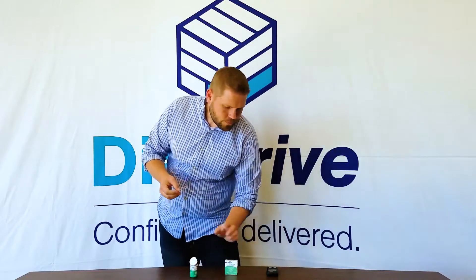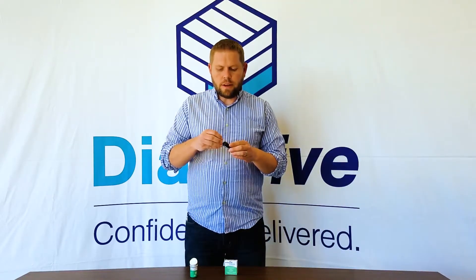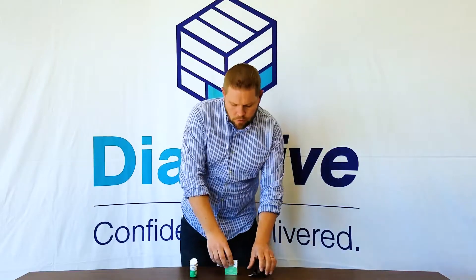So it's really simple. To use control solution, all you need to do is pop out a strip, pop it in your meter just like you're going to test some blood — and I'll get some close-ups in here so you can see exactly what I'm doing.